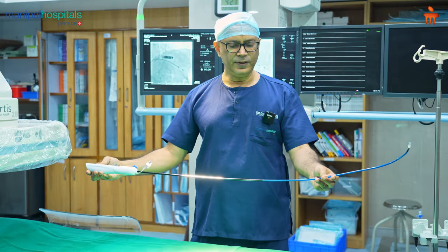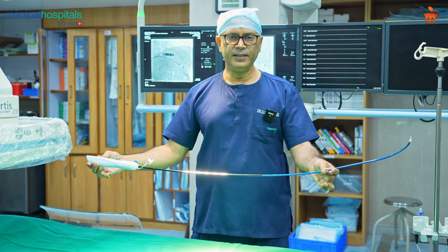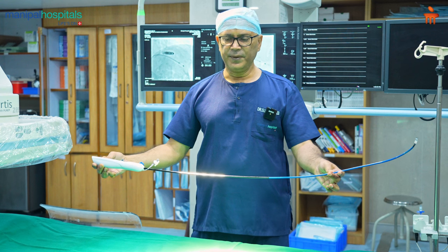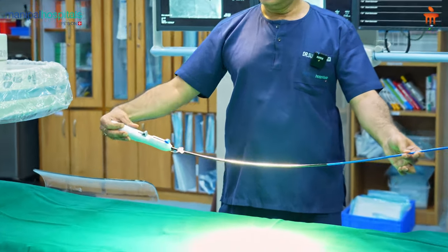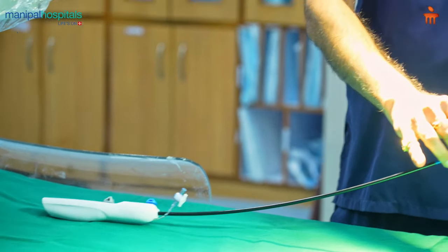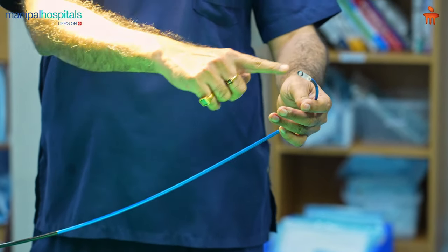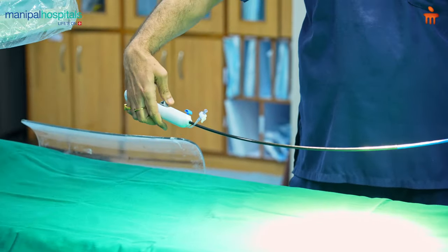I'll show you one device which we use to put it. You can see it's a simple single device delivery system which is used to put a leadless pacemaker. This device has a handle where all the controls are there; a single operator can manage it, and this is a shaft which goes up to the heart from the leg. You introduce this portion from the leg, go up to the heart, and this portion is flexible so you can easily do the control.